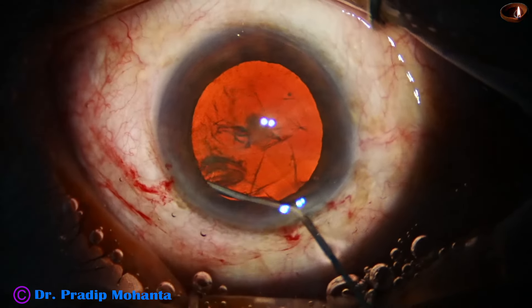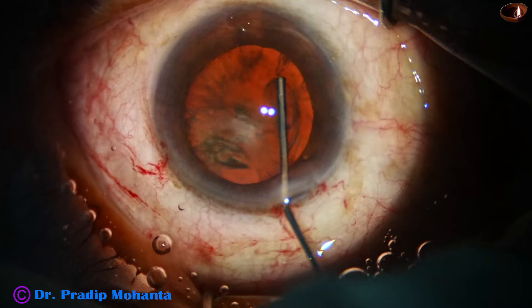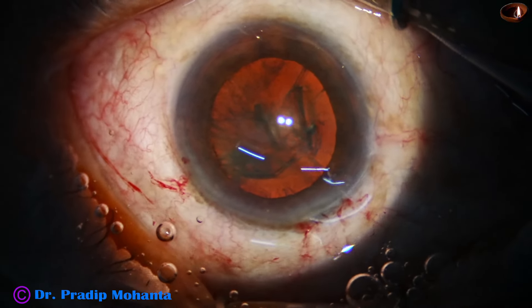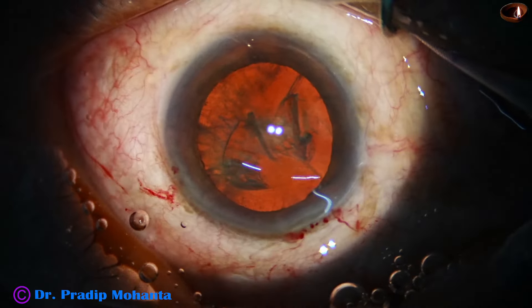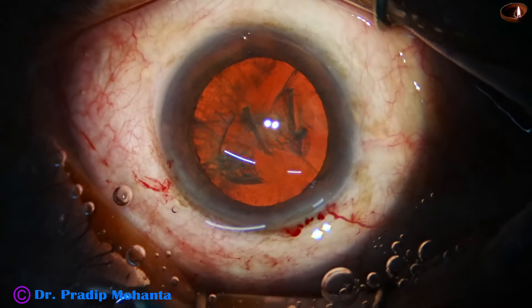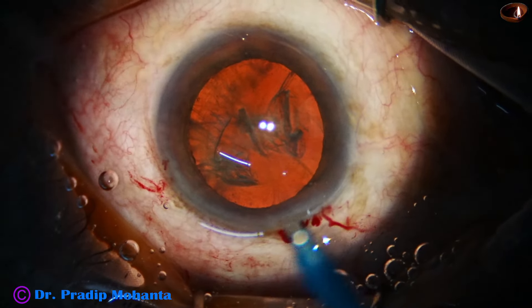I did it deliberately because the cataract is hard and I need a large rhexis. You can see a very good fluid wave during hydrodissection — the nucleus is tapped, the fluid comes along the equator anteriorly, and the hydrodissection becomes complete. Some more viscoelastic is added to fill up the anterior chamber.